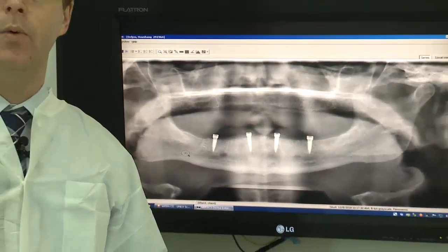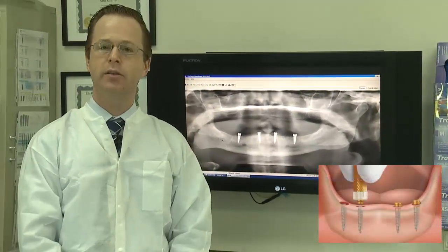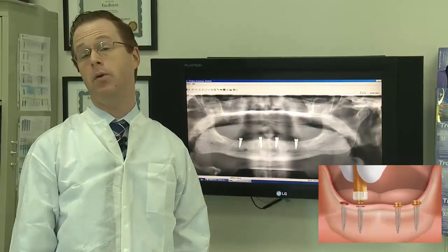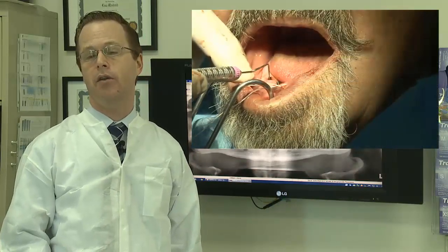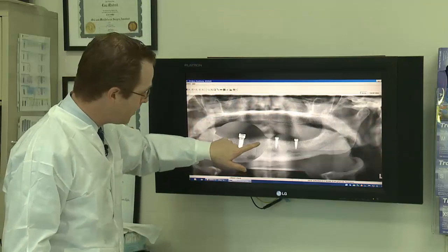We also wanted to verify the full abutment seating. This is always dynamic — how we run our live courses here at UNLV — because we had our first instance where an abutment wasn't fully seated, and we could see how that would happen on 19 and 30, just to ensure we get proper prosthetic space. Take a look here at the number 30 position.